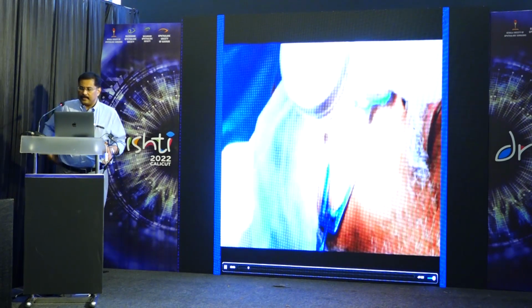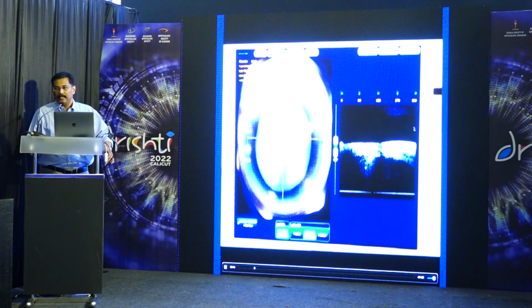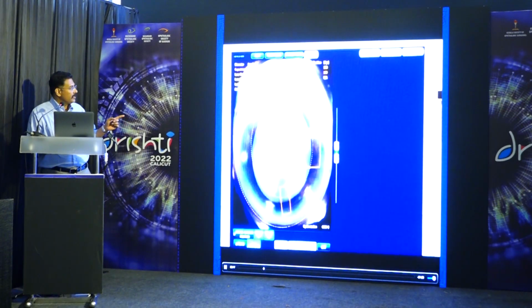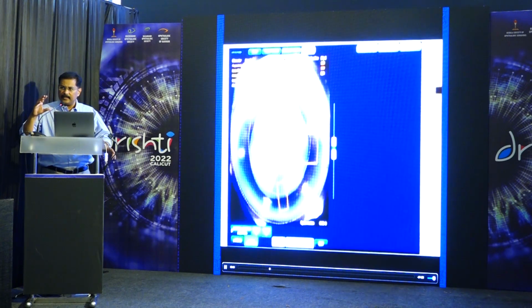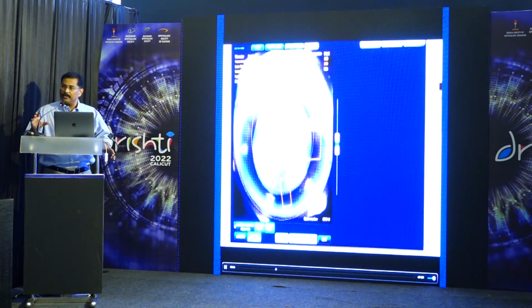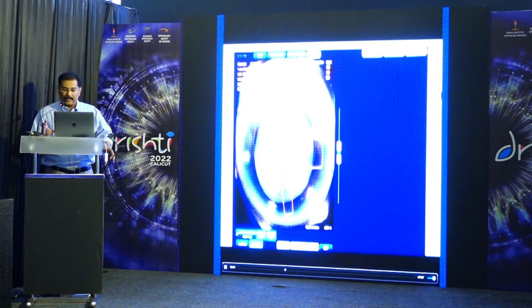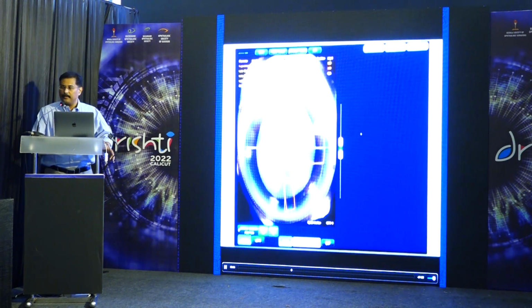In some patients, this is one difficult situation, they cannot see the spotlight specifically. So we may have to redock. This is one case where the docking is not very central. See, this space is more, so it is a little tilted dock. But we can still readjust the location of the rhexis and the nucleus treatment according to the position of the eye, because many times once you redock, the patient becomes more irritable, and you may not get it right. So if once or twice it is still not possible, then you can proceed with this also.